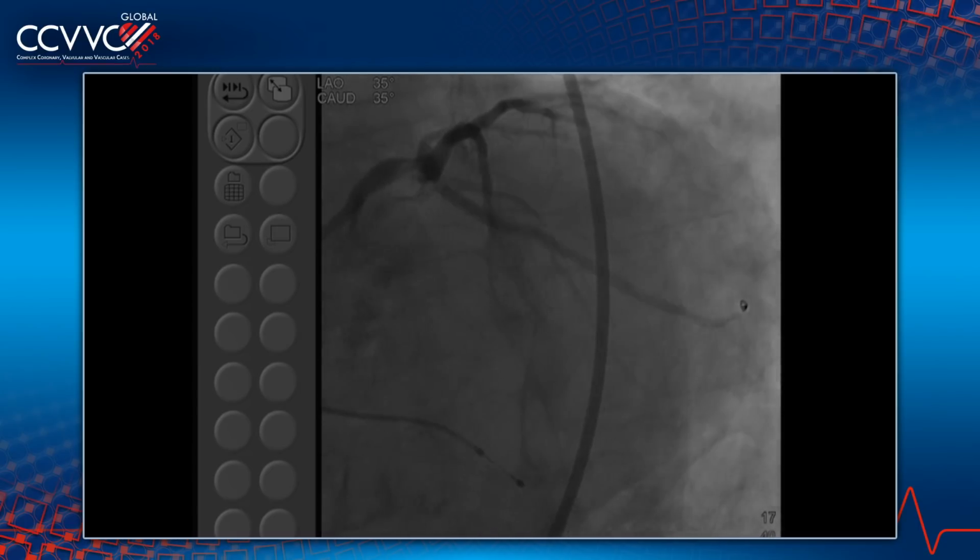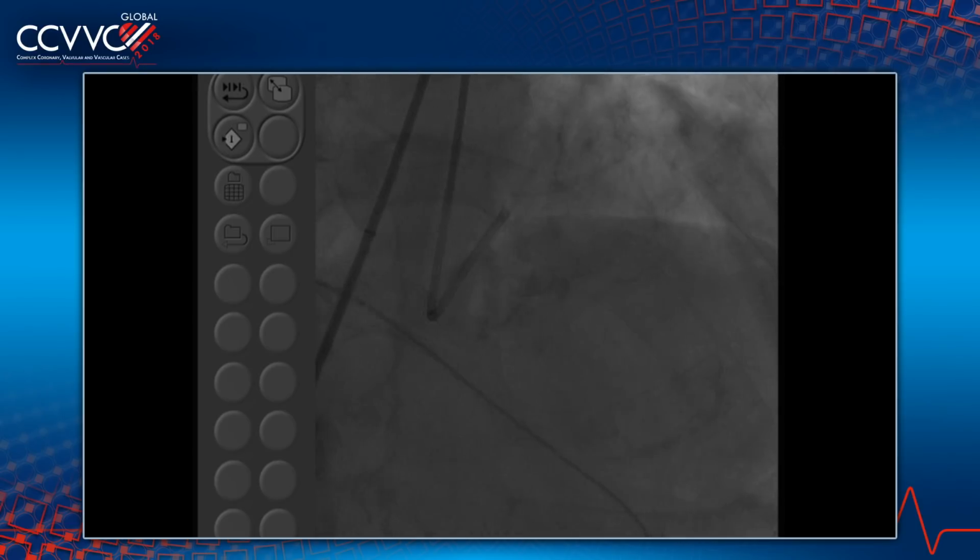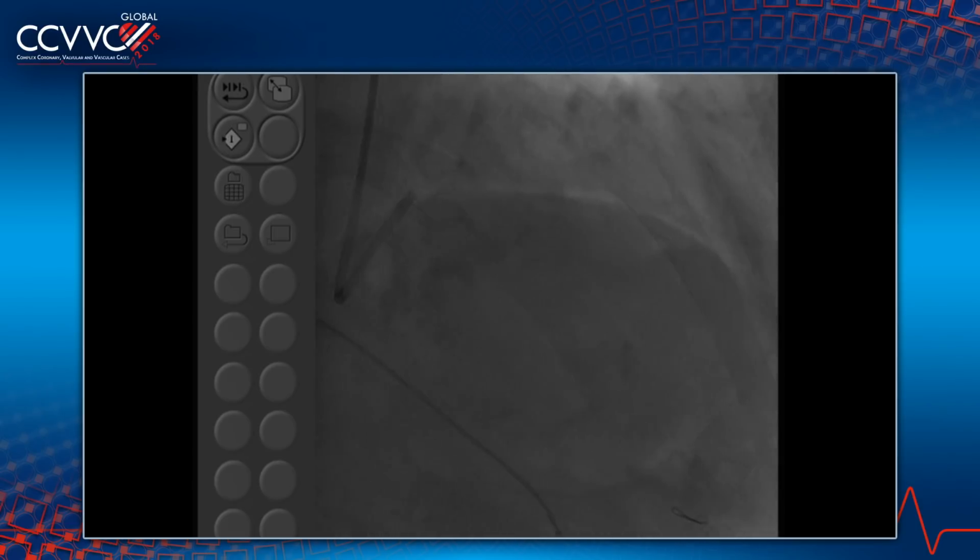As long as the coronary heights were high enough and the elbow was okay, we would actually put an Impella in after the BAV, and then go ahead and what I think we're going to see is a rotablator of the left main. Okay, very interesting. Chet? To me, the calcific bifurcation left main is probably a trickier procedure than the TAVR. I would do the TAVR first, stabilize the patient, and then do the bifurcation left main. Eberhard? Yeah, I would do the same thing.